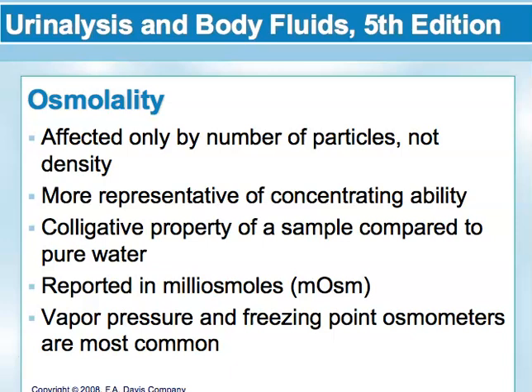Serum and urine are both tested for osmolality, and a result from each sample is usually done so that the results can be compared. The unit of measure in this methodology is the milliosmol, and we already mentioned that vapor pressure and freezing point osmometers are the most common.